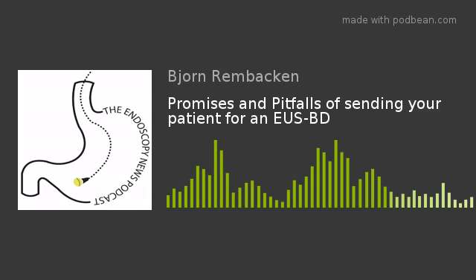I don't think that it should be replacing good and standard and conventional safe ERCP technique. In patients who have preserved ampullas and preserved major papillas, failed conventional biliary cannulation would usually lead to performing an ancillary technique such as a pre-cut papillotomy or a needle knife fistulotomy, which are very safe, especially if they're performed reasonably early on rather than waiting an hour into the procedure to perform them. They're reasonably safe and they have a very good success rate.